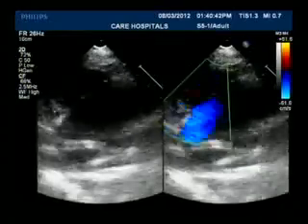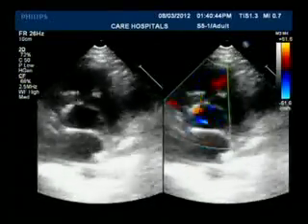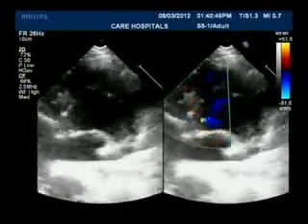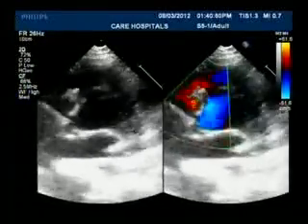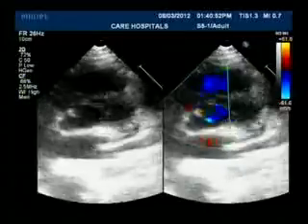So I think we are going to release once we confirm, even echocardiographically, that the discs on either side of the septum are well seated. You can show the echocardiogram, please. Yeah, you can see the echocardiogram, the device on either side. Can you see, Dr. Radhakrishna? Yes, we can see. The echo pictures are much better than the fluoro images.